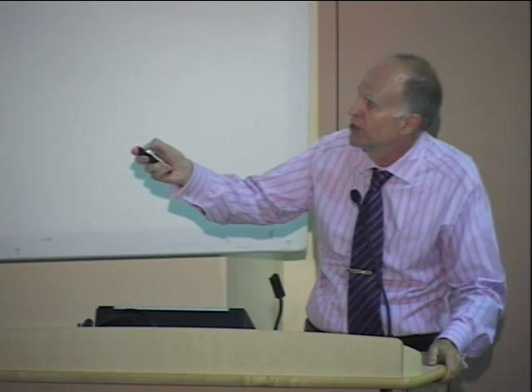And you can see here in the middle image, all of the areas that are dark blue means that it behaves the same as the previous tissue. So that's easy to understand in this case. Dark blue means zero. So if the signal is the same at two pixels and I subtract it, I'm going to get zero. So it's not that simple, but it's that idea.